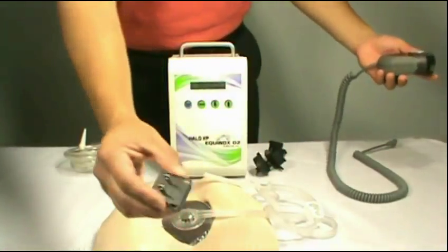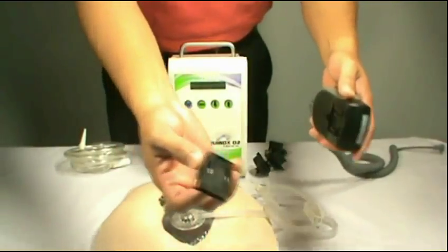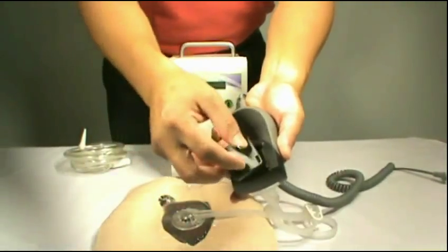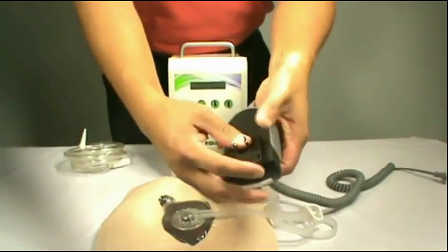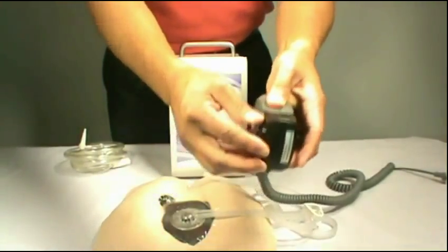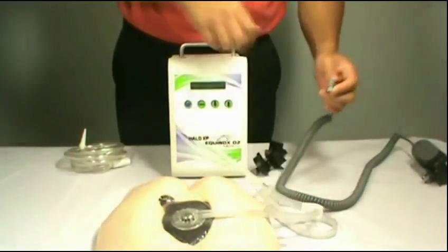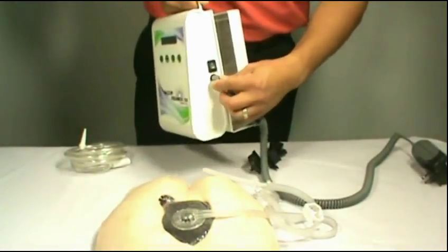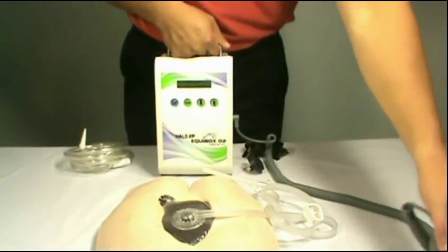Choose your appropriate power outlet adapter and connect it to your power adapter. You should also hear a snap on this one to signal or to let you know it is properly secured. Connect the power adapter to the Halo XP and connect your power adapter to any power source.